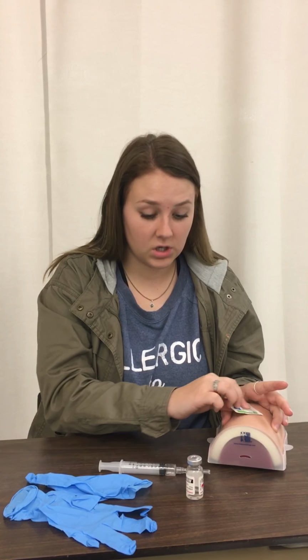So then when giving the injection, you're going to make sure that you clean the area really well. And after you get that medication, you may want to change the needle just because it can dull the needle. So you want to make sure the needle size is the correct length and the gauge. And so you'll want to change out that needle for that. You don't want a dull needle.